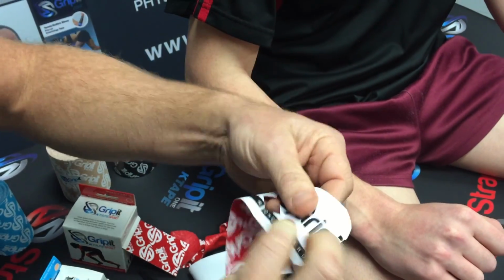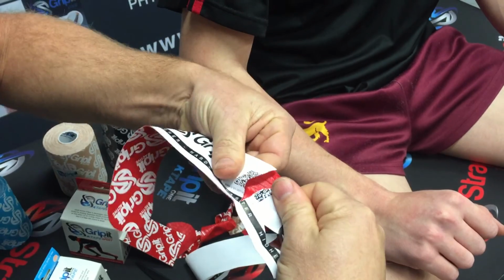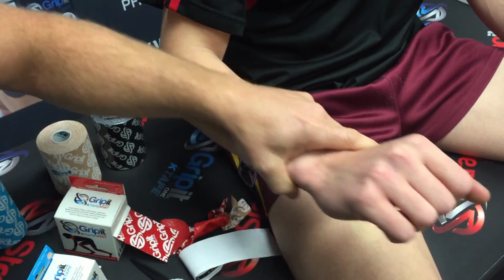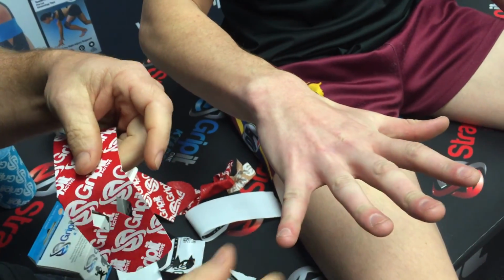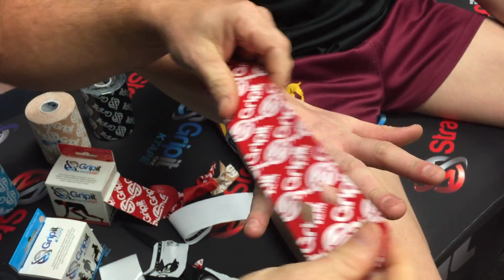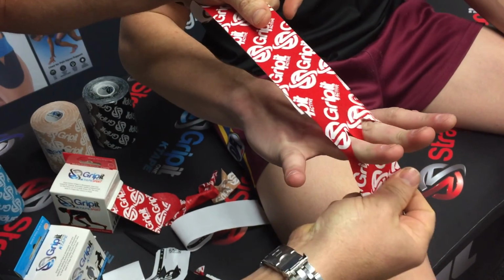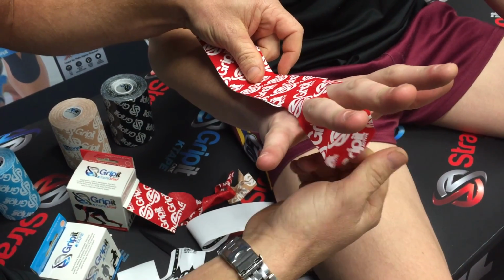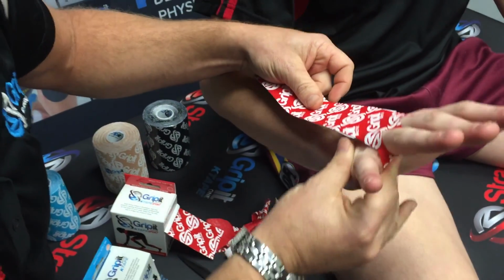Okay, so what I do here, everyone does it a bit differently, but I generally cut the tape, tear the tape above and below the diamonds. Daniel's going to open up his fingers for me. You can choose to go wherever you want, and I don't have the 7.5 today, we're using the 5 centimeter. You definitely could use the 7.5, and you pass this through the fingers, like that. And so we just peel the backing paper off here, and there our anchor comes into the palmar aspect of the hand.